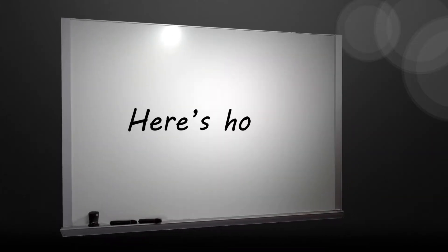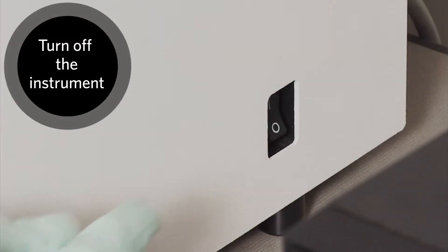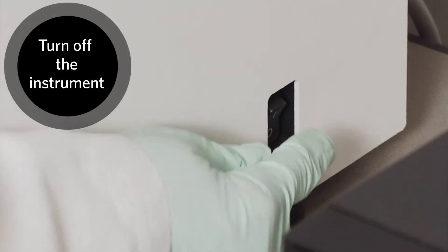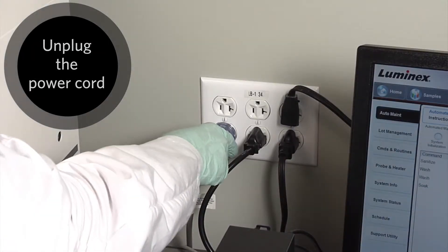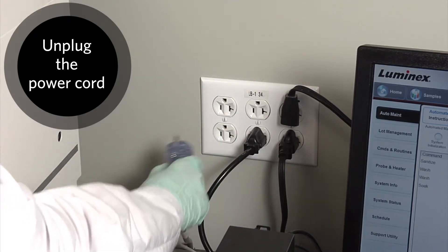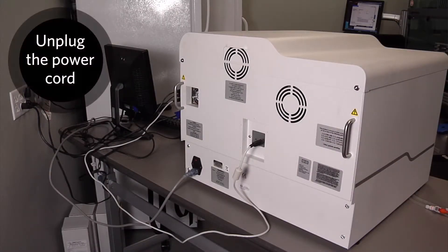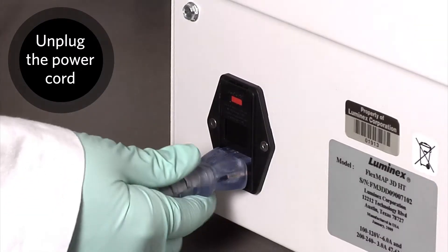Here's how to replace the fuses on the FlexMap 3D. Turn off the FlexMap 3D instrument and unplug the power cord. Unplug the power cable from the instrument.